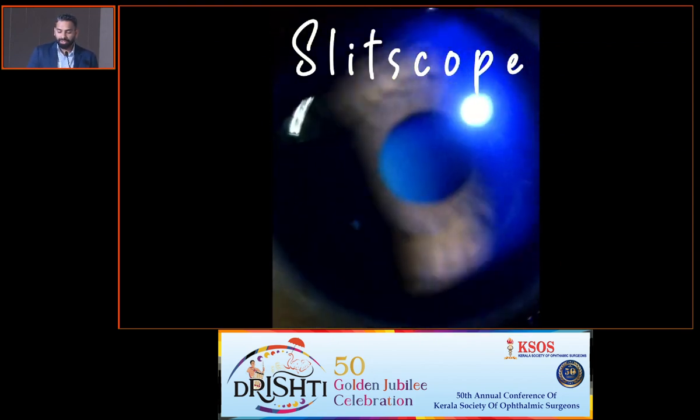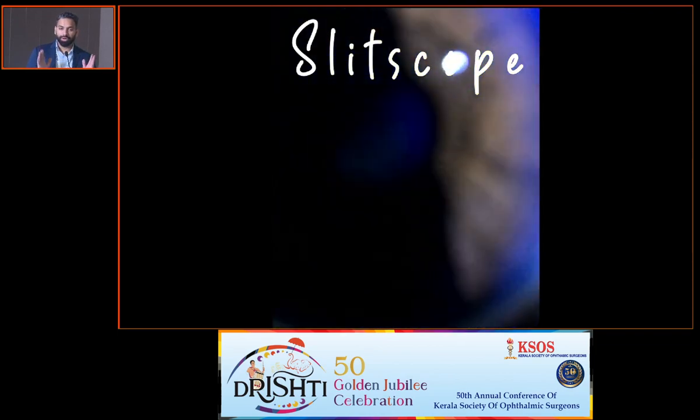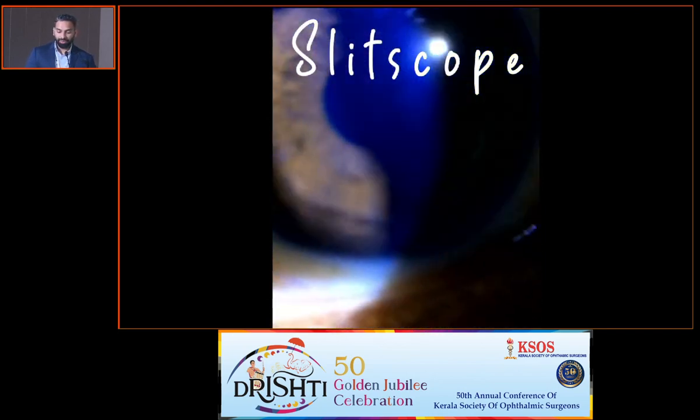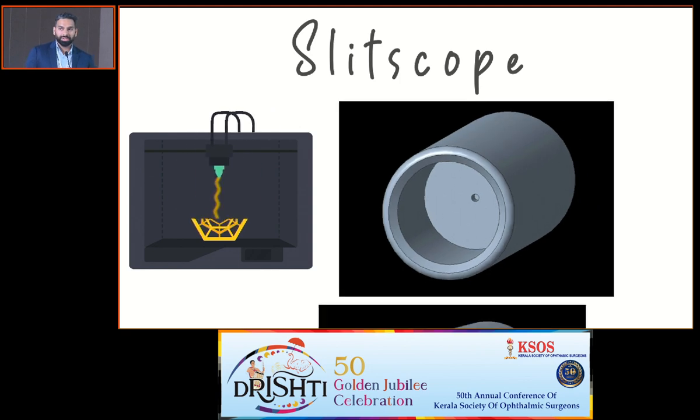And this is the first image which we took on my own eyes, and you can see the slit has come, but it is a little broad. So we can actually change the slit width accordingly. So this is the first time we tried, so it was a little broad. And then we thought, why not start 3D printing this?